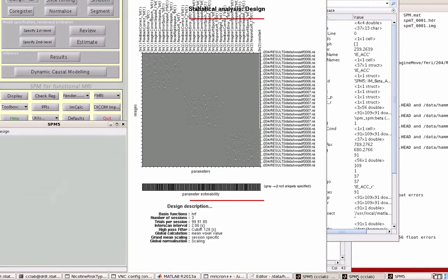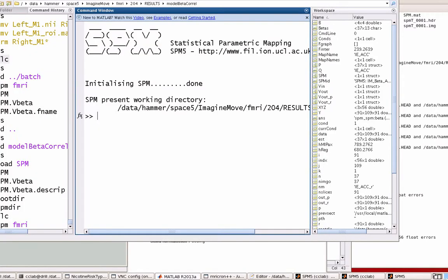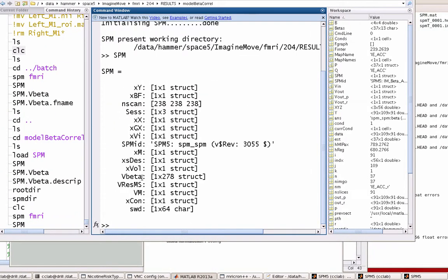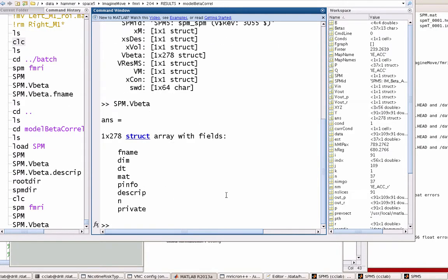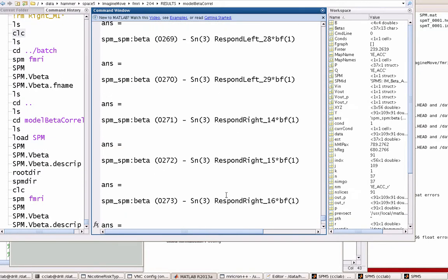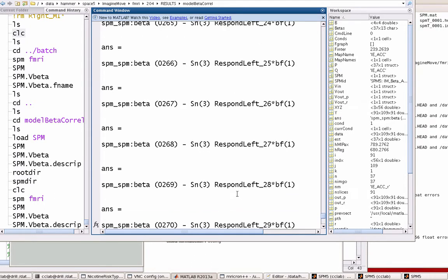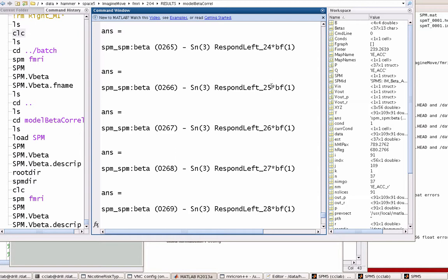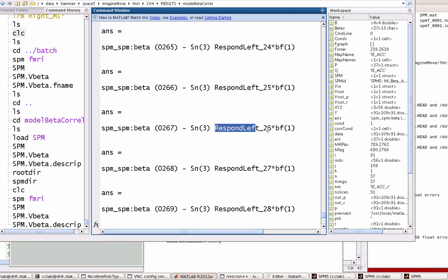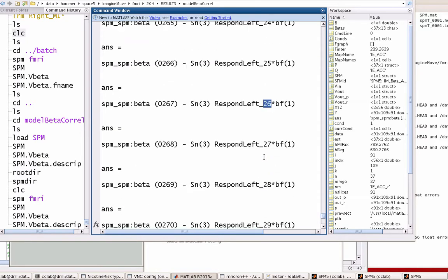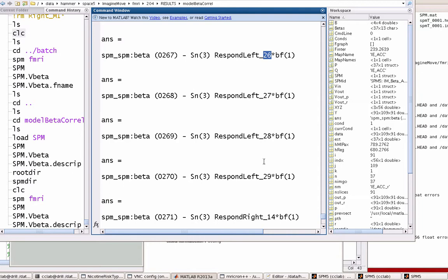If I look at the actual SPM file — let's go back to MATLAB. In the actual SPM file, notice in this vbeta structure is where all that information is going to reside. The script is going to show you what each of these were called, what they were labeled before they were put into the model. Notice here, I have things like respond_left, respond_right. This is a task where they did other stuff as well, but we also had their left and right motor responses, so it gets tagged whenever they did one of those responses. The setup is the name of the regressor — in this case, respond_left — an underscore, followed by the occurrence of that regressor. This goes up to about 20-something across all these different runs.